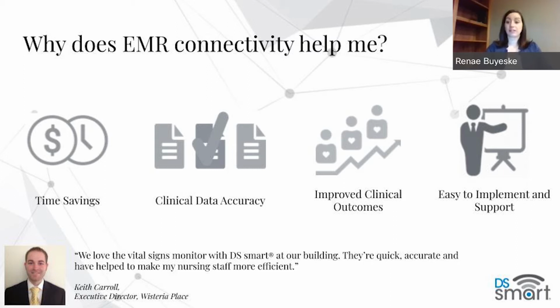Last but certainly not least, as you'll see when we go through our video in a little bit here, DS Smart is very easy to implement and support. Now, the last thing that buildings need is another thing to manage, another thing to worry about, and another thing to get set up and started in the building. Rest assured that in under 5 minutes, everything can be connected, sending data, and staff trained to be able to confidently go out on the floor, do their rounds, and get the efficiencies and benefits of using DS Smart and connecting that clinical data directly to your electronic medical record.